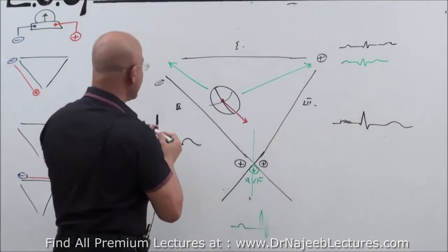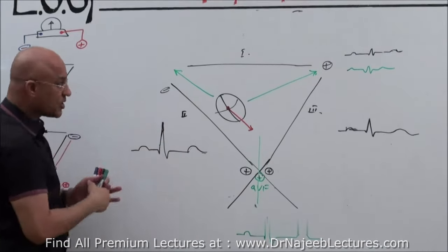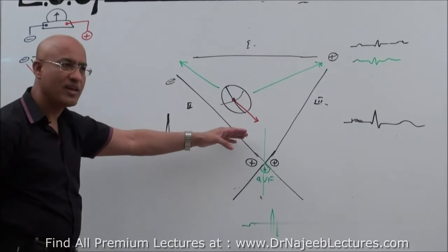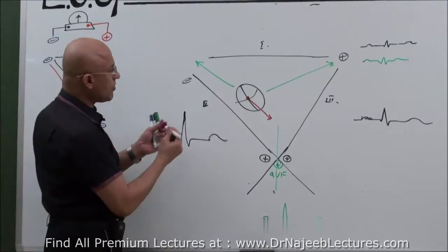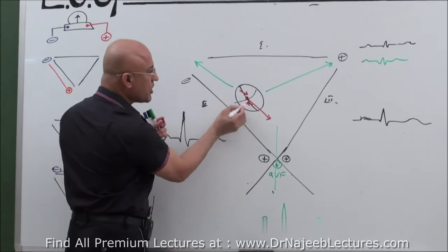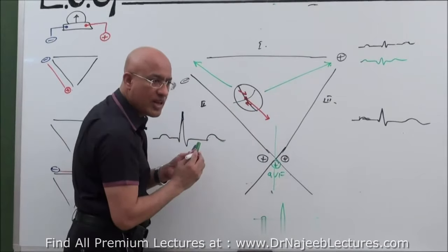The real thing is the pattern drawn by the AVR. Because here is the boy who is looking from there, and she is moving away. Will the deflections be mainly positive or negative? Negative. Now, here even the P wave, atrial depolarization, will move away. Septal depolarization will move towards. Major ventricular depolarization will again move away.